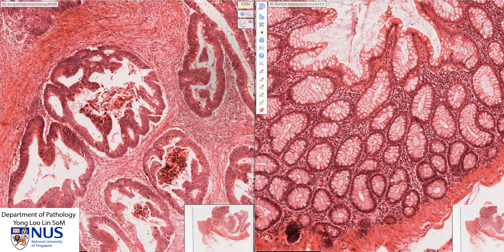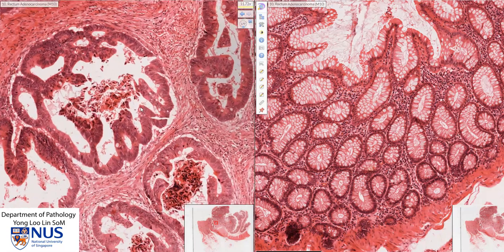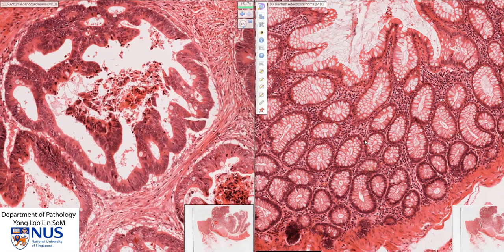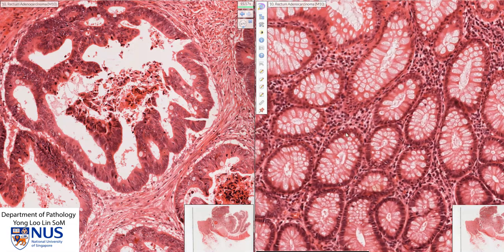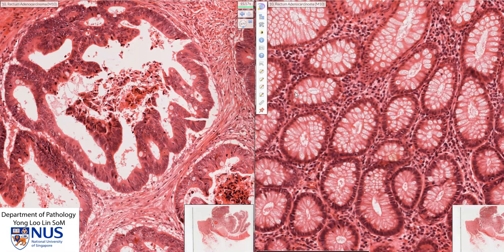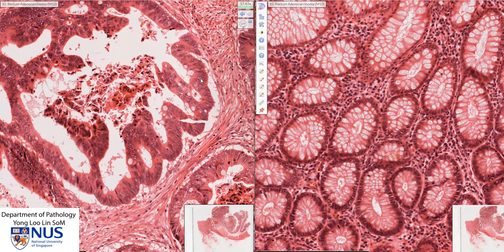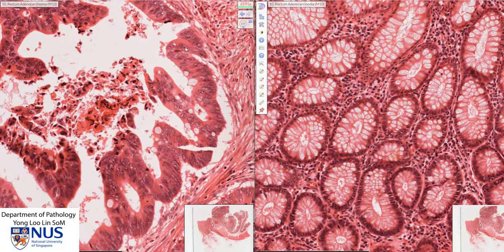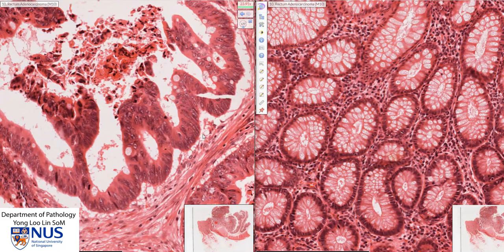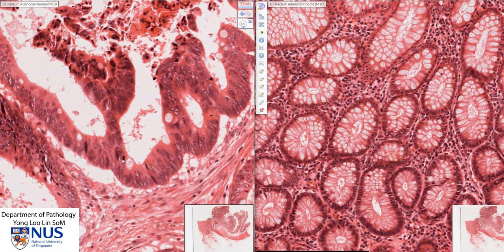This is also a good time to compare the cytomorphology between benign and malignant. In the benign crypts, the nuclei are all peripherally or basally located, and we have a lot of goblet cells. In contrast, in the malignant tumor, the nuclei are much larger. Some cells have prominent nucleoli. The nuclei are stratified, more pleomorphic, and we can also see very plentiful mitotic figures.